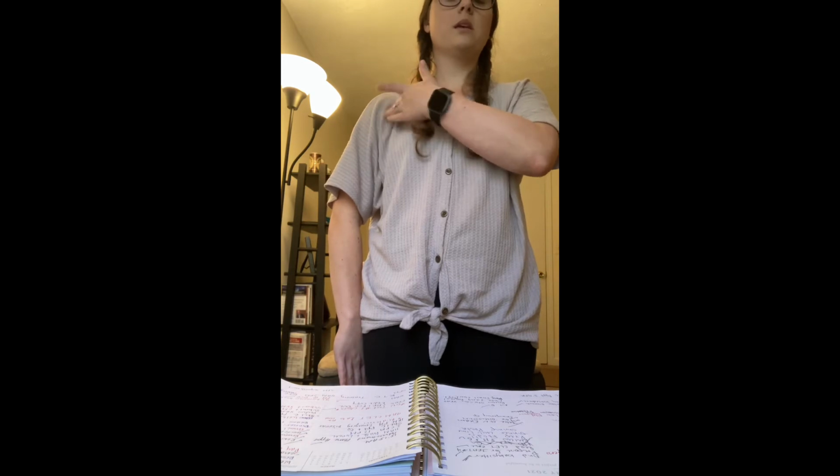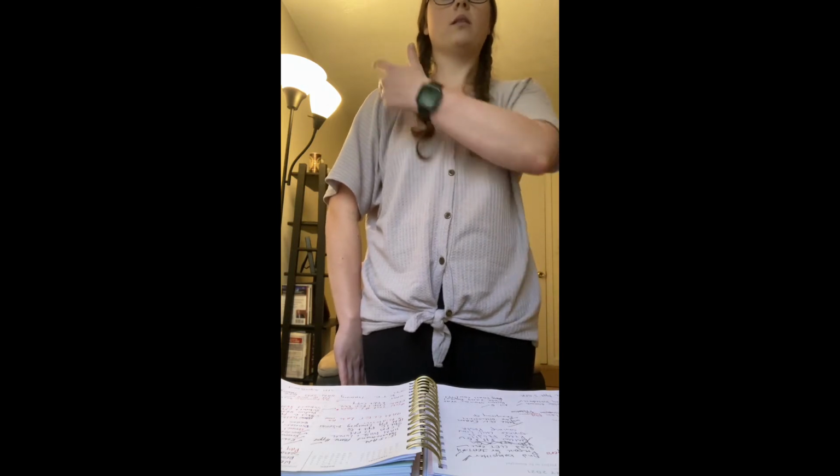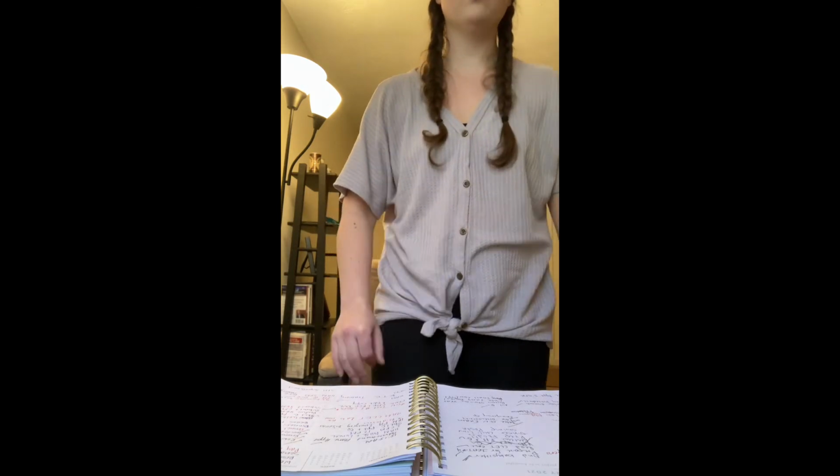We want a line through the epicondyles to be perpendicular to the film plane, and we again can have them turn their head away. Central ray is still perpendicular to the coracoid process, and you can see the lesser tuberosity near the glenoid fossa, and the greater tuberosity on the lateral side for this view. So that's internal rotation.